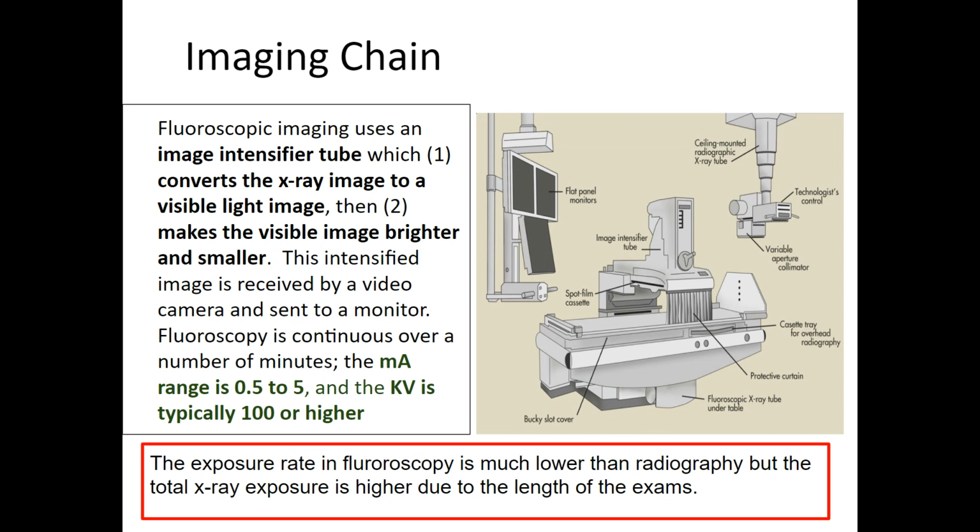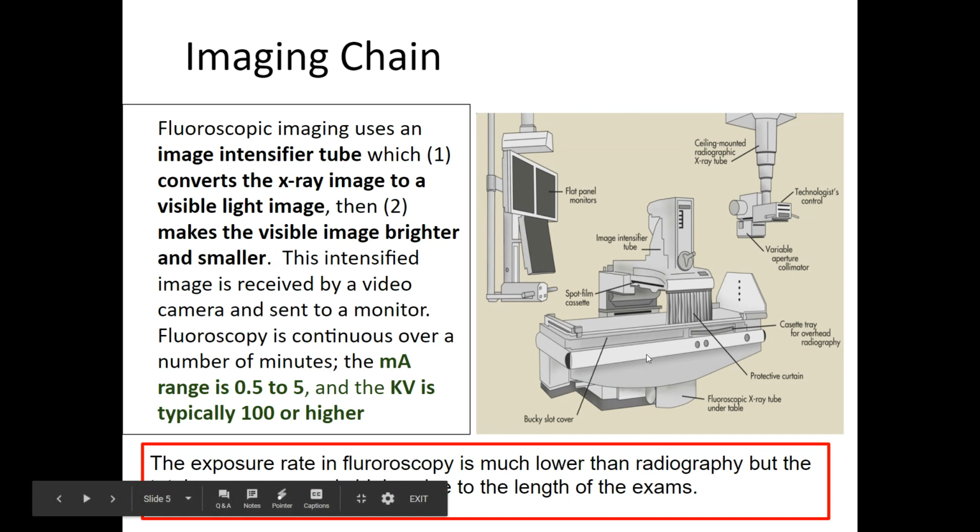So if you multiply, let's say, what's 3 minutes in seconds? 180 seconds? So 180 times 5 is how much mAs? That's a lot. Even if we don't do the multiplication, just 180 is a lot. I mean, if you do a knee at 8, that's like 18 knees. Just right there, without even multiplying by 5. And that's without doing more. That's only 3 minutes, before the alarm even goes off. So it can get much higher.